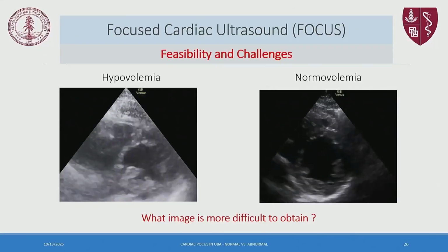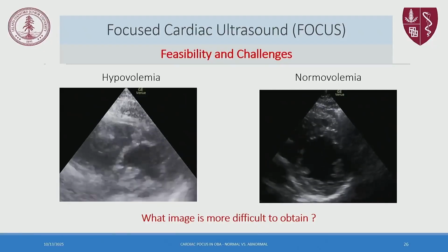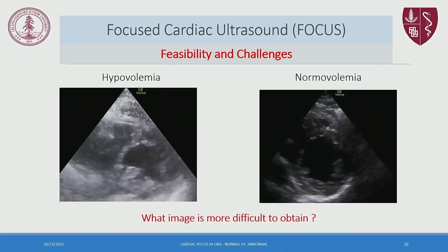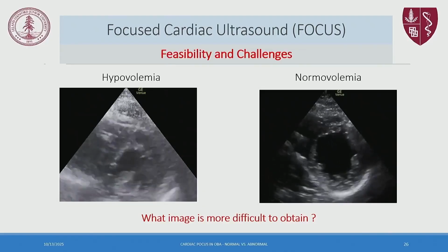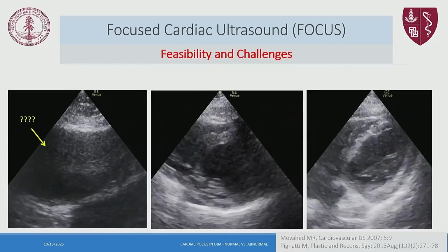And I want to tell you one thing, don't worry. It is very difficult when they are so hypovolemic, because the preload is so low that it makes the image acquisition much, much more difficult. So don't get frustrated. Once you resuscitate the patient, it's getting much easier.